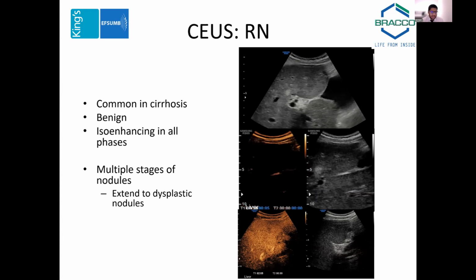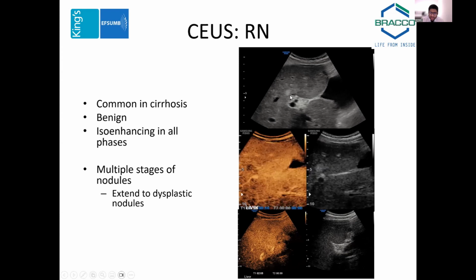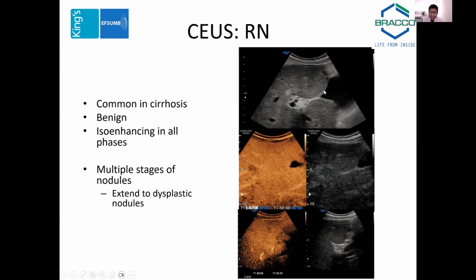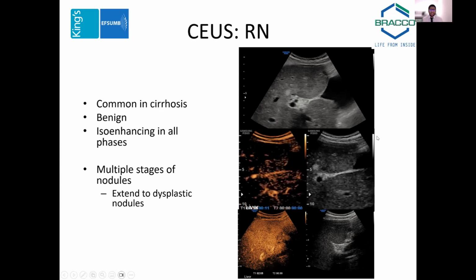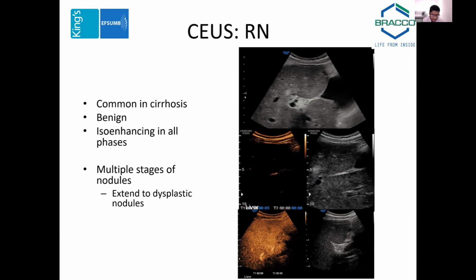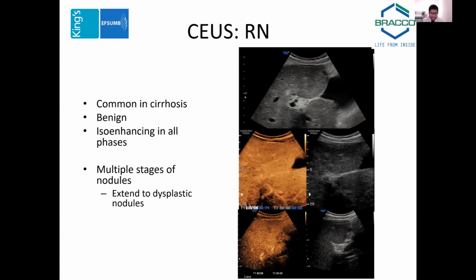So in this case, we can see that although we've got a small hemangioma, this hyperechoic lesion at the porta, which was shown, there's also this larger nodular looking area adjacent to the gallbladder. What this is, is part of normal liver still, similar to how we described focal fatty sparing infiltration. So it does iso-enhance in all phases.